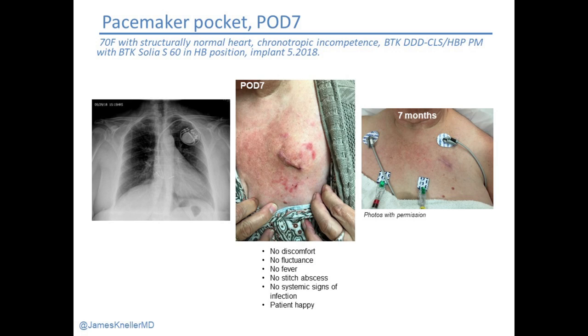Every time I take off the steristrips I'm wondering if there's any evidence of infection. What happens when you pull off and see a local rash? Here, she's a week out with just a local allergic reaction to the steristrip — it might be itchy but it's no problem, it will completely resolve. We don't give antibiotics for that; we reassure the patient. The device looks nice and tightly closed. Sure enough, seven months later her scar is very much flat and all of this has resolved.